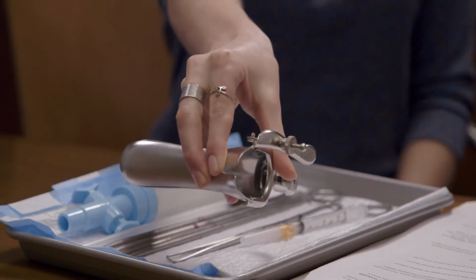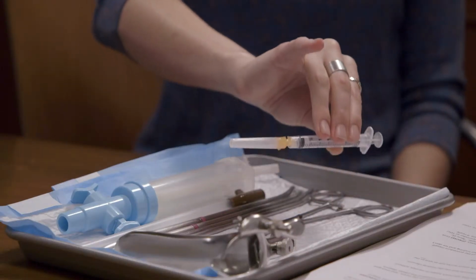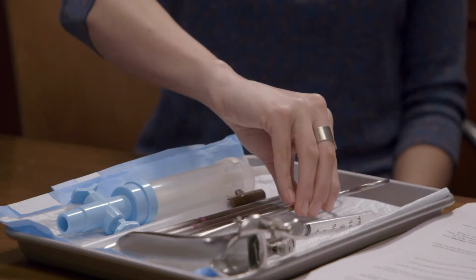Yeah. Now, let's focus on the procedure. I keep a model tray here for learning. Can you tell me what the steps of the procedure are? Yeah, so first I'm going to start with the bimanual exam to check the position of her uterus. Then I'm going to insert the speculum so we can visualize the cervix. And then I know some places have some sort of antiseptic wash and other places don't. Yeah, we're not doing that here. Okay, so then I'm going to give a little bit of lidocaine before using the tenaculum, give the rest of the paracervical block.